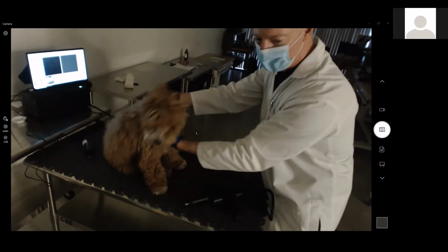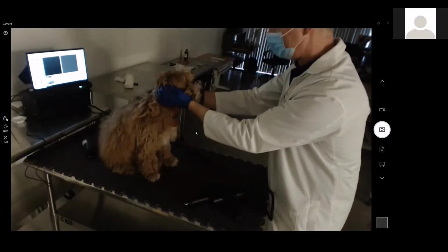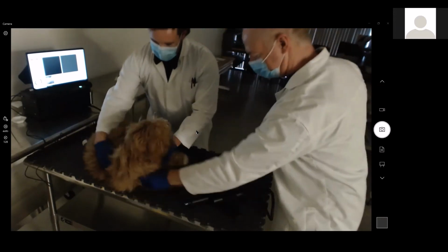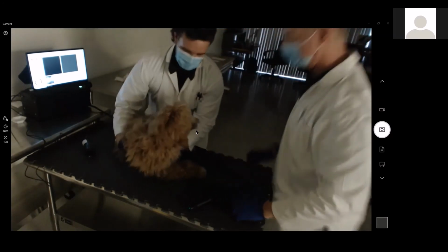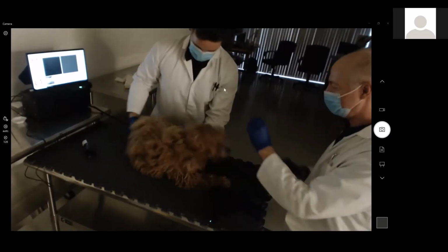Sorry, folks, we're doing a quick changeover again. We're about to run out of battery power on one of the systems, so we're just powering that up real quick. Are we good? We're good. All right, come here, Axon. Go ahead and let him sit up if you can. Here, bud, come on.